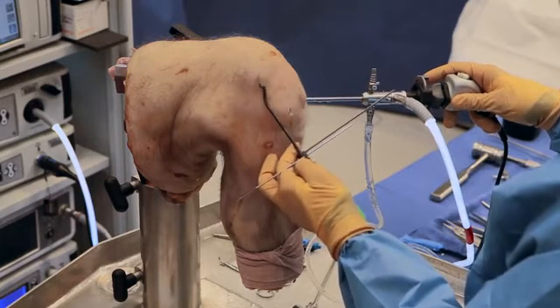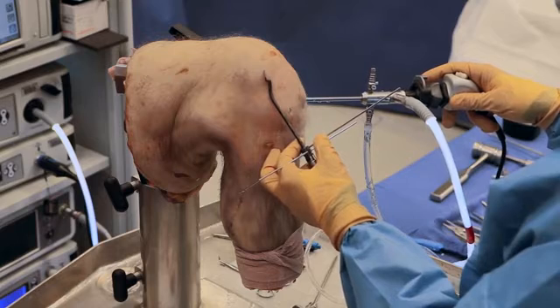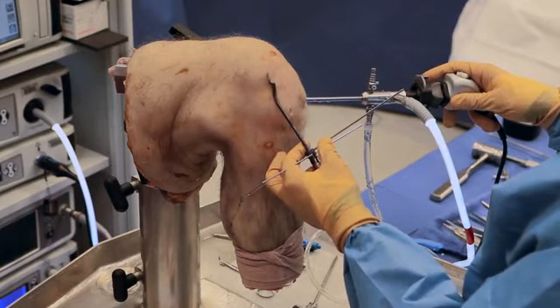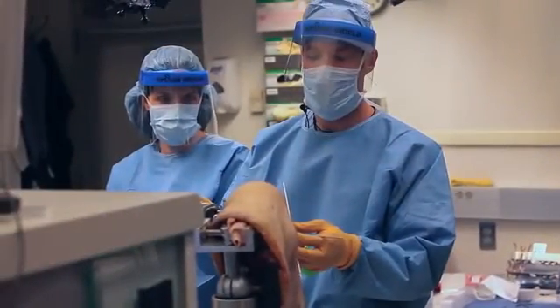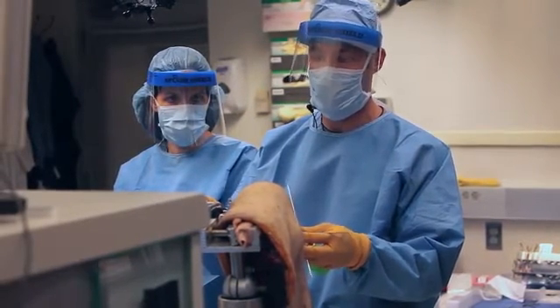The concept here is that you want to line up the coronal guide with the joint line, and then the trajectory will show you an estimation of where your pin will exit the lateral cortex. Clearly, you don't want the pin to come too vertical. You don't want it to come perpendicular to the lateral cortex, and you don't want the pin to exit too low, which would suggest that you're going to have a very short tunnel.